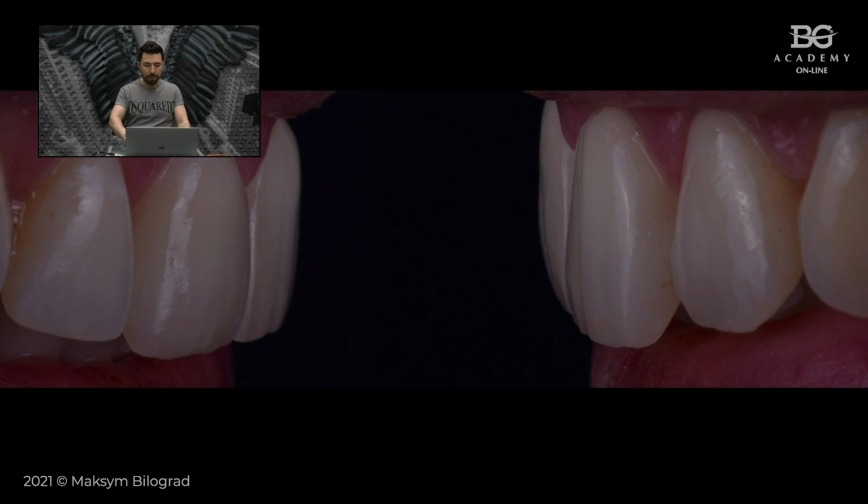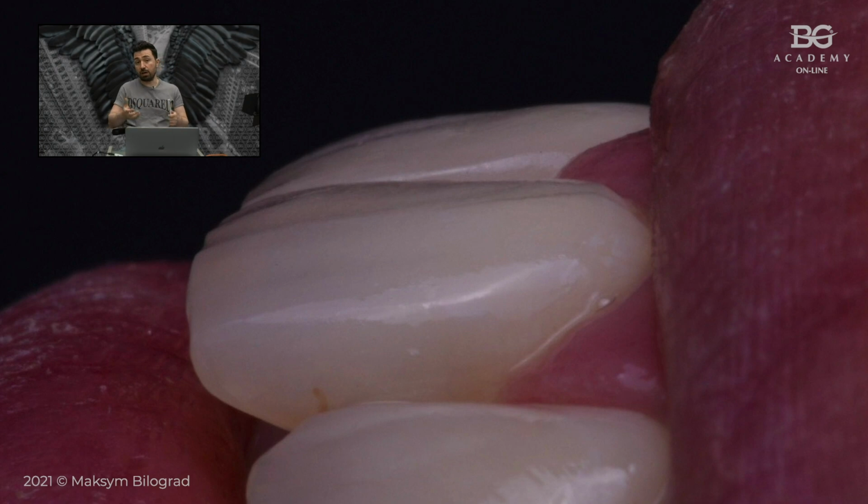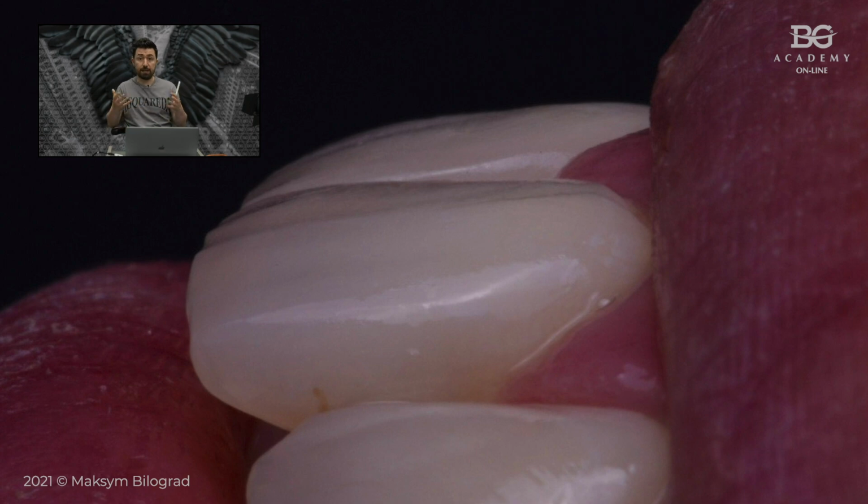restoration and rubberdam removal. Here you can see before and after, and on that slide you will be able to see the texture, the relief, the structure from the lateral view. And you can see also the integration of composite restorations into the biological and optical environment of our patient's teeth. So that is the final slide for that restoration.